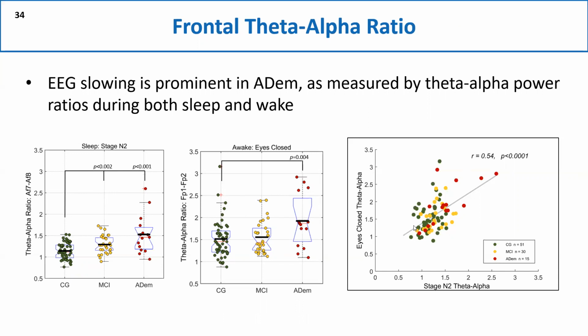But we do see a very nice correlation between the theta alpha during sleep and wake. This is just an example of the work that we're doing where we're combining the sleep and the wake in order to add to the biomarkers that I had expressed and showed you earlier.